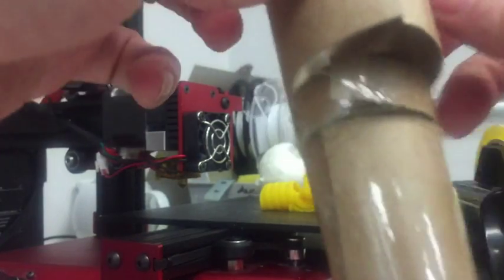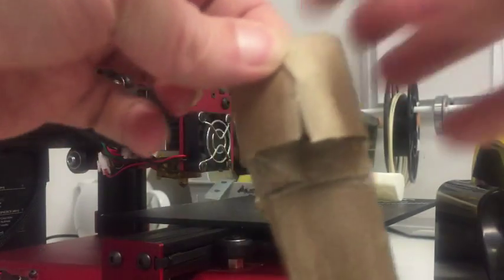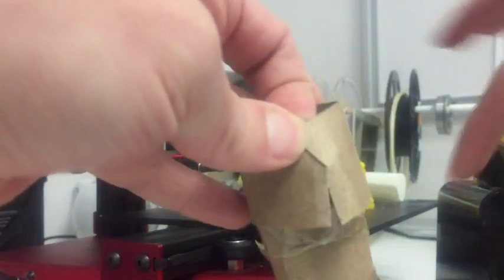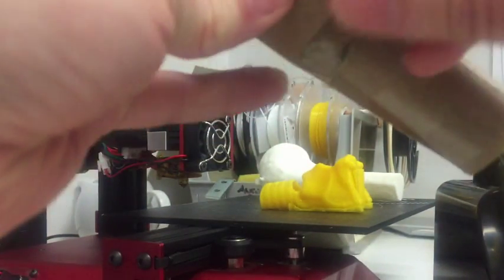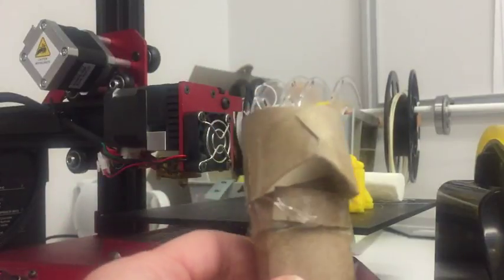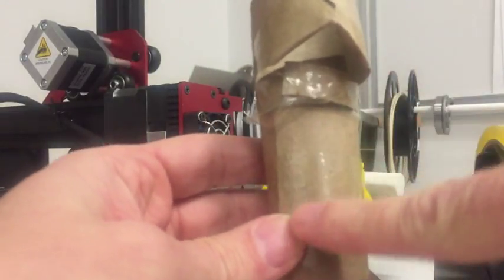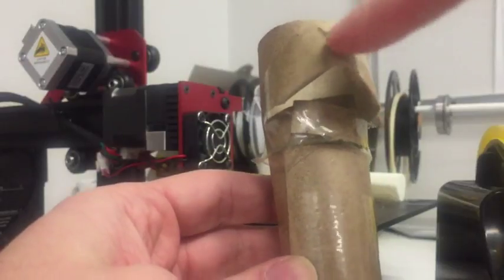Next thing to do is do a little bit of origami folding. Actually, probably want to fold it over a bit more. There we go. Grab our tape. Stick it over. And now you've got the beginnings of that laryngeal prominence, the thyroid cartilage prominence. I'll fold this right over and in. Okay. So now you can see we've got our trachea, cricoid ring, cricothyroid membrane will go in there, and the thyroid cartilage.